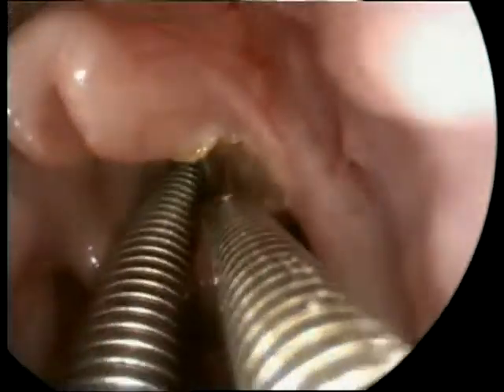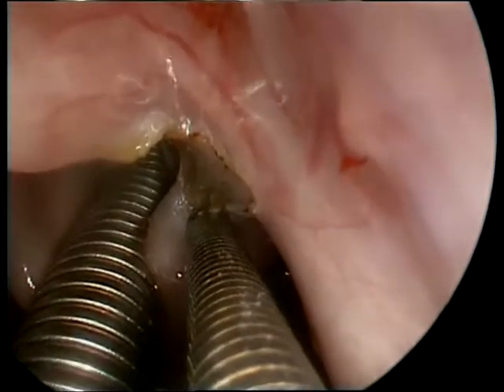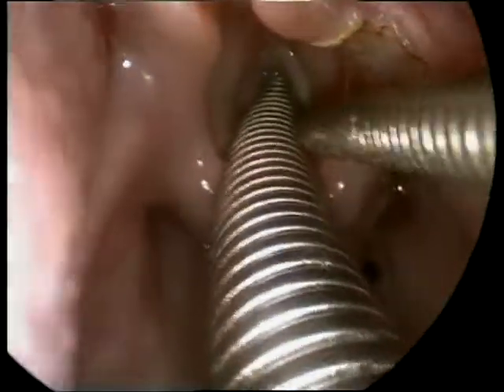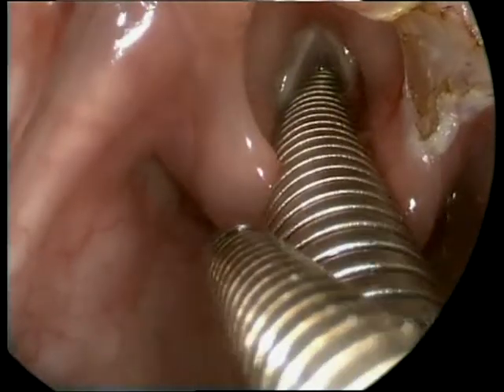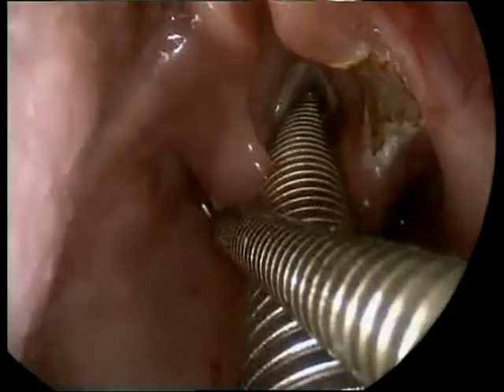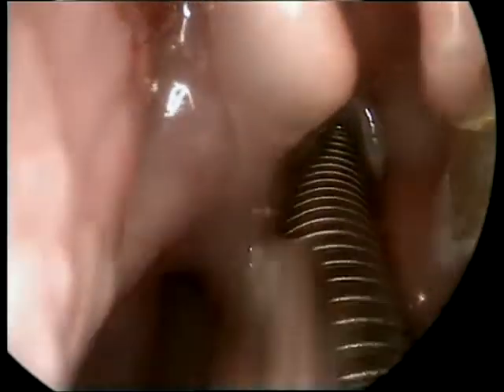These images are being captured using a four millimeter zero degree nasal endoscope. The child is lying supine on the operative table with suspension laryngoscopy position achieved, fully paralyzed and anesthetized. We move on to the left side as the right side seems to be adequately managed.